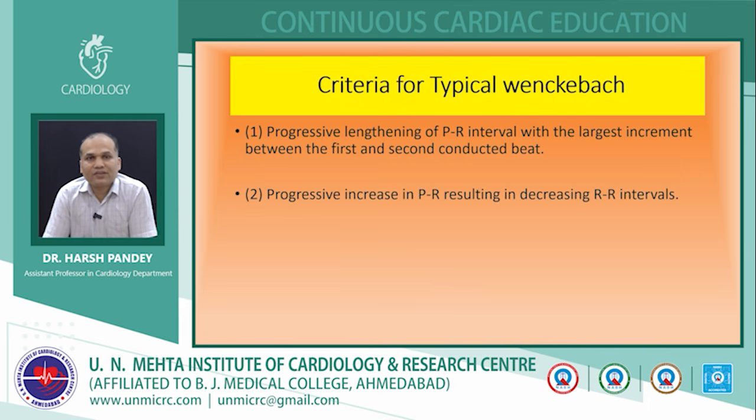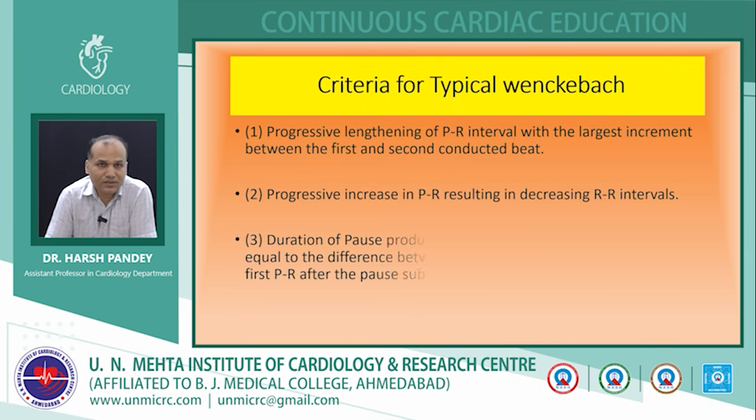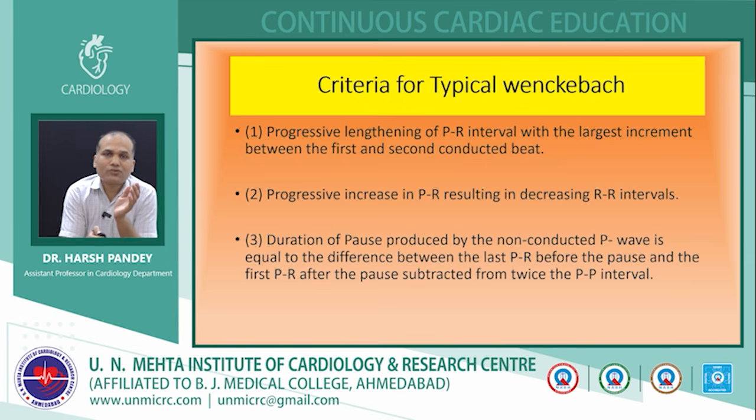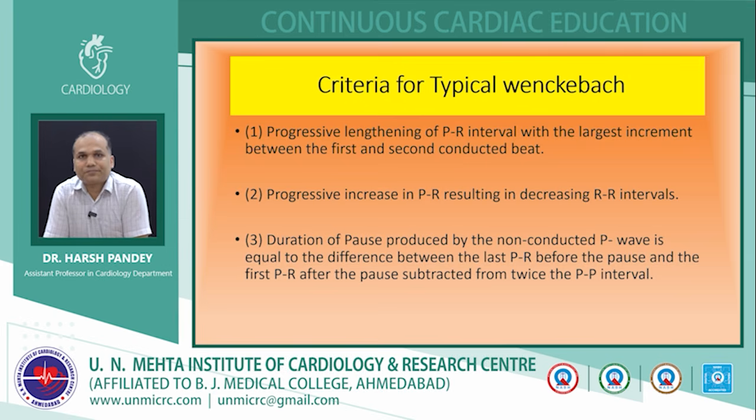In the second criterion, there is a progressive increase in the PR interval resulting in a decrease in the RR interval. That we will understand in the ladder diagram. Third, the duration of the pause. All of these things we will understand through the ladder diagram.